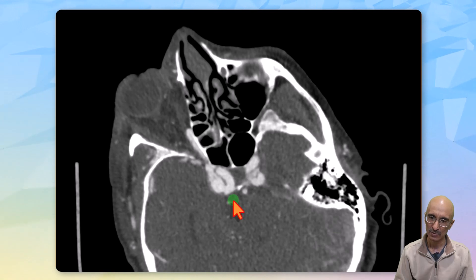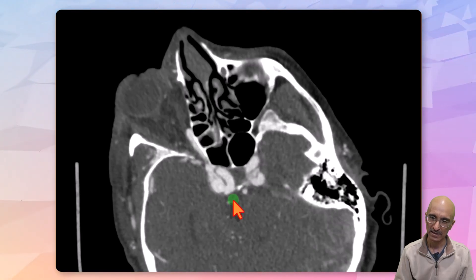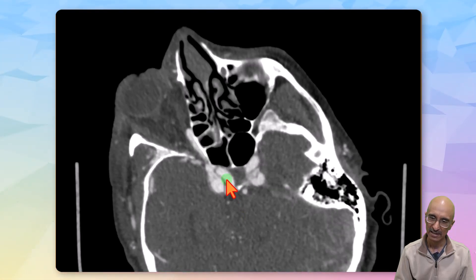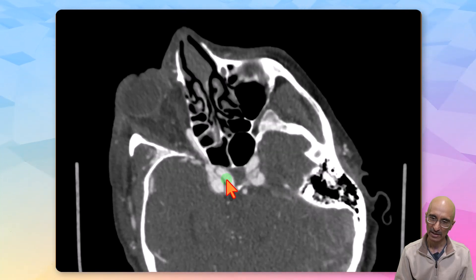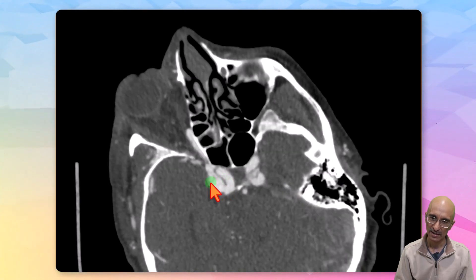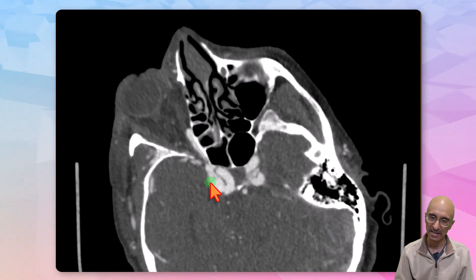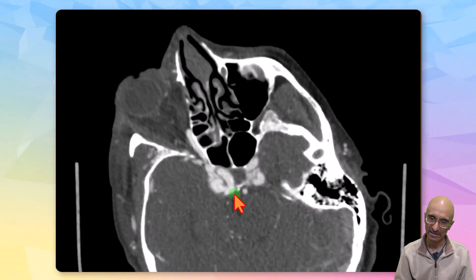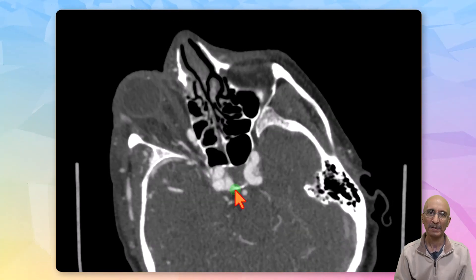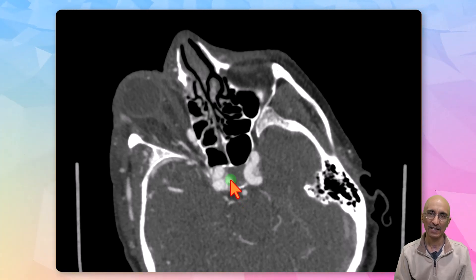There appears to be a direct communication between the right cavernous segment of the internal carotid artery and the cavernous sinus. We can also see asymmetrically dilated, bulging right cavernous sinus. Imaging appearances are concerning for a direct carotid cavernous fistula.